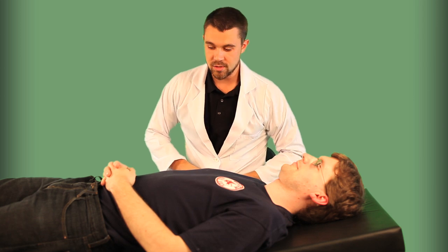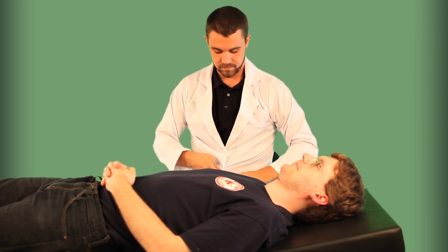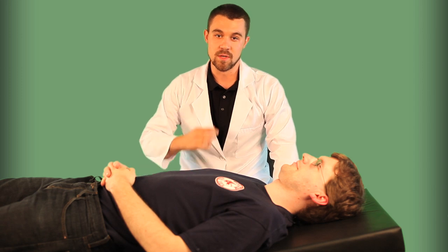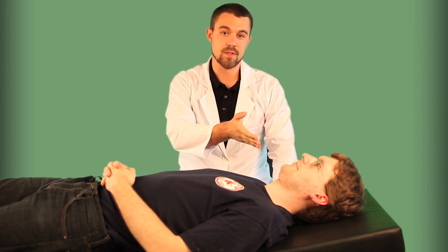Once you get situated, get yourself in an ergonomic position. Now you want to measure the distance from your nose down to the clinical point of interest.